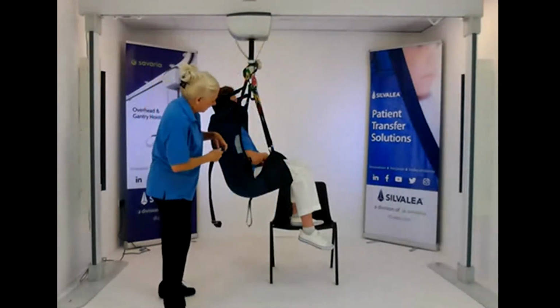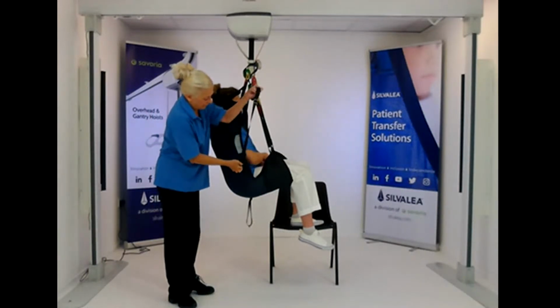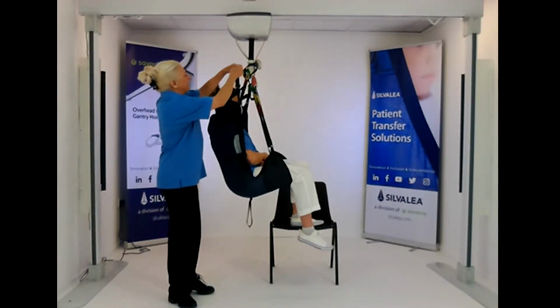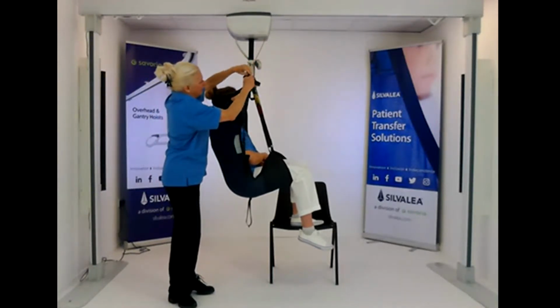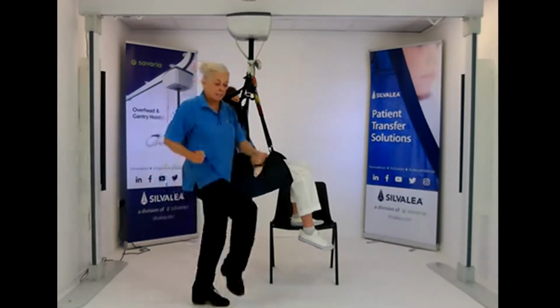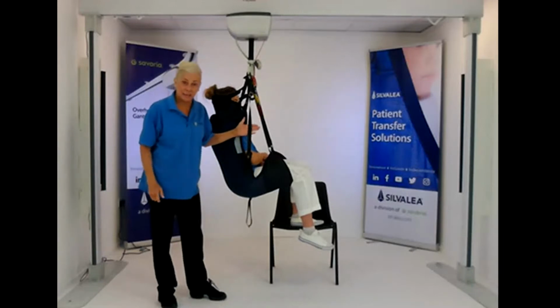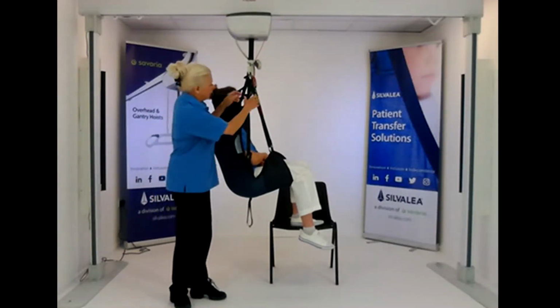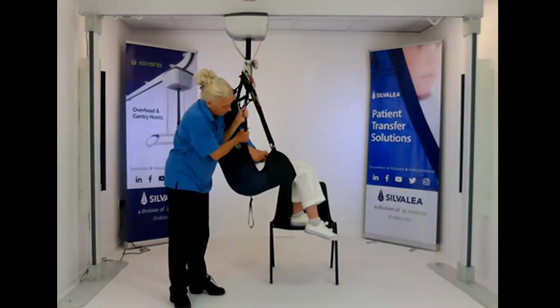But if I just attach it, it feeds through, knots back on itself. And we need to set it so the tension is the same as the leg. So we need to pick them up simultaneously. It's a bit loose now, it's not doing anything. So I'd have to just take Laura down and take the tension up properly. But it will literally just lift.